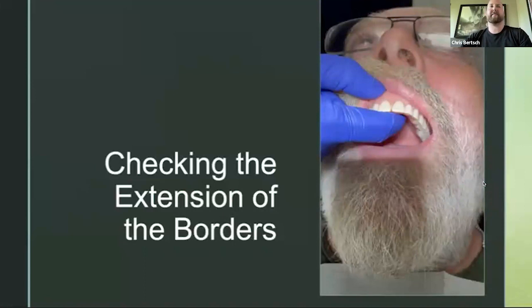And like I said, it's a whole process of setting expectations and talking to the patient. So up to this point, he's been aware, he knows what's going on and why it's happening. So the one thing I'll say is that with the digital dentures, I find that we're not getting that extension of the flanges into the vestibule where it's digging in as much, and we need to adjust it.